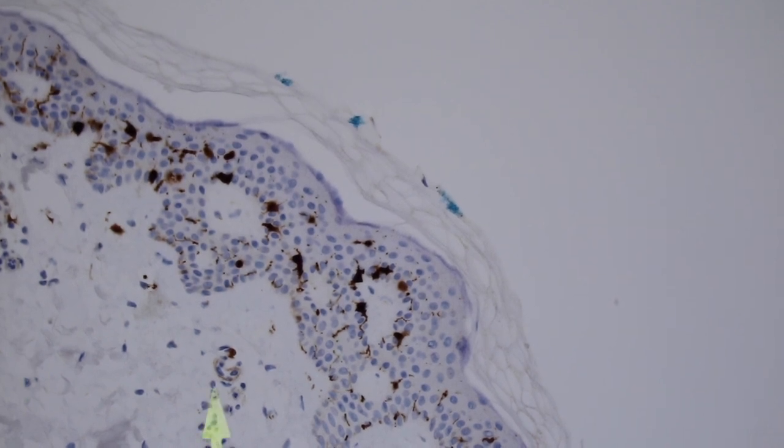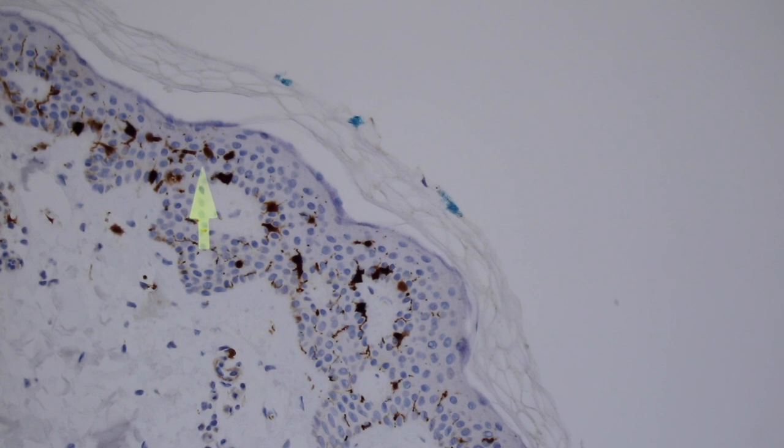So you have S100 positive melanocytes down at the basal layer, and then also Langerhans cells, which are antigen processing cells, up there in the mid portion of the epidermis.